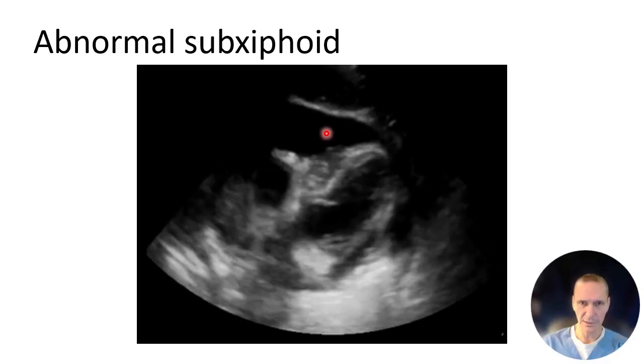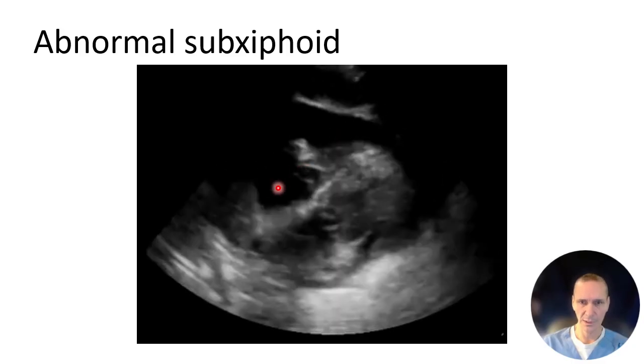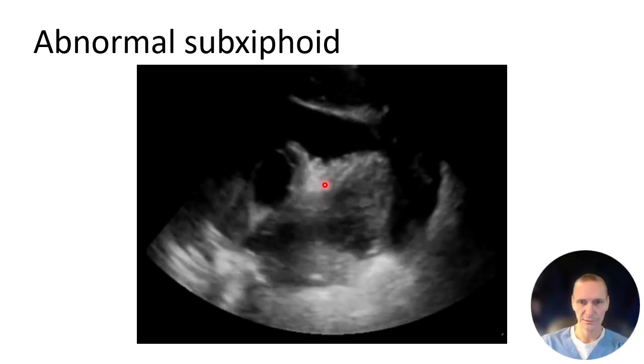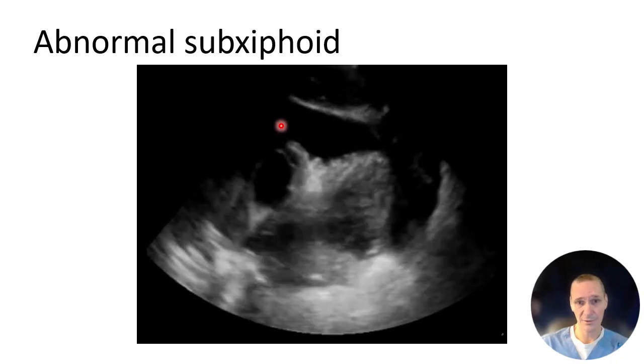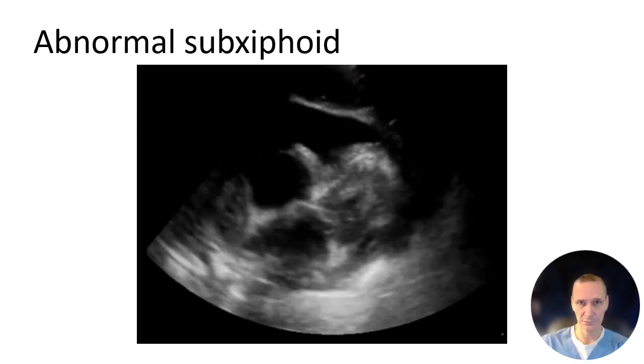But what this is telling you as a clinician is this guy has no preload. This is an emergency, and this may warrant emergent thoracotomy. Somehow, somebody has got to get this fluid out.